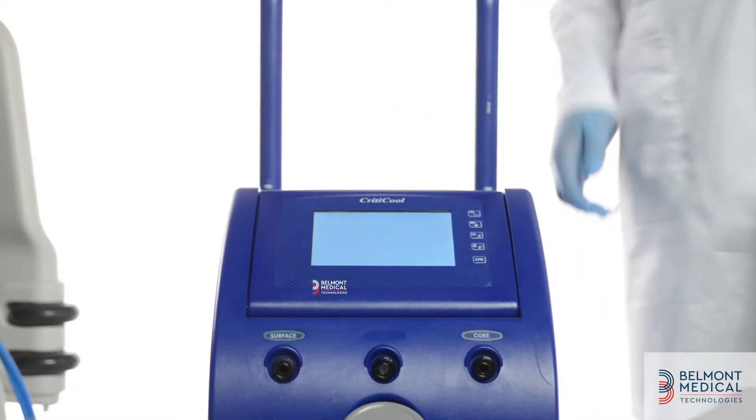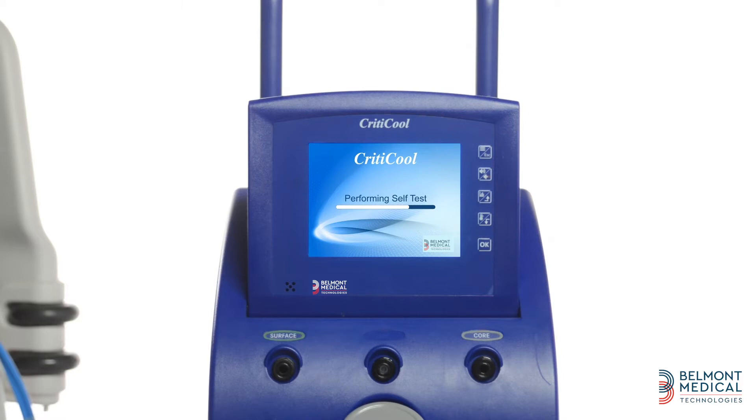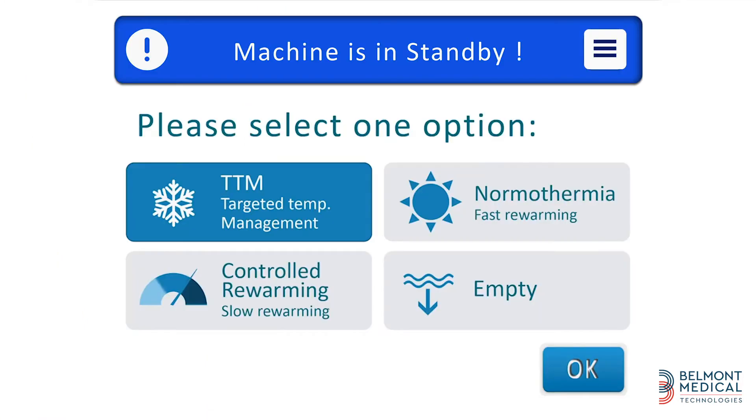Now we can turn on the machine. When turning on the power, the system performs a self-test. This self-test will take a few minutes to assure the system's safety. When finished, a select mode screen appears.